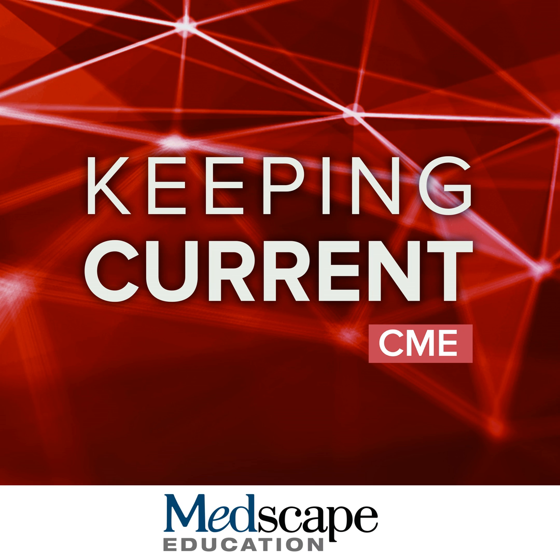So again, we've differentiated those AD therapy enrollment and AD therapy monitoring exams because there are different relevant findings in each of those scenarios. So that baseline or enrollment exam is performed to identify any exclusionary findings for treatment, as well as provide a baseline for future comparison. Whereas on the monitoring exams, again, we're identifying ARIA and reporting a relevant severity score.